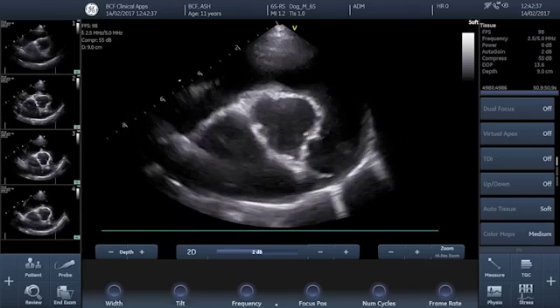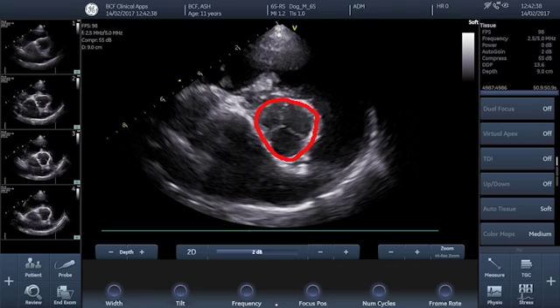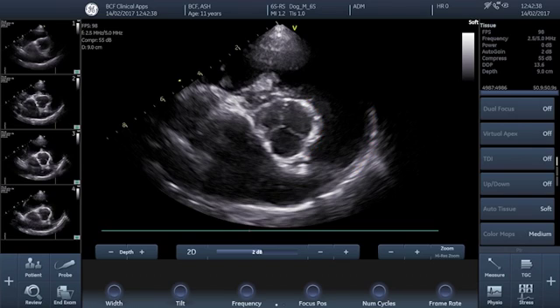If we just pause the image for a second we can review the anatomy. In the centre of the screen the almost round structure is the aortic root in cross section, and we can see the aortic valve leaflets meeting in the middle to create the Mercedes-Benz sign that gives this view its name. Over to the right of that we can see the right ventricular outflow tract curling round, and below the aorta we can see the sort of tail of a comma which is the left auricle.